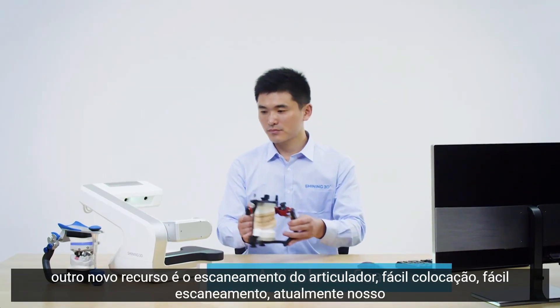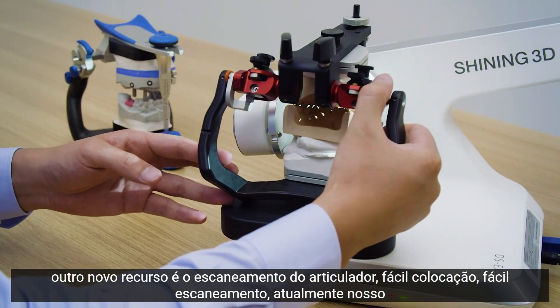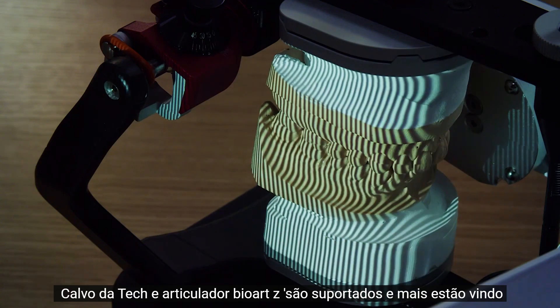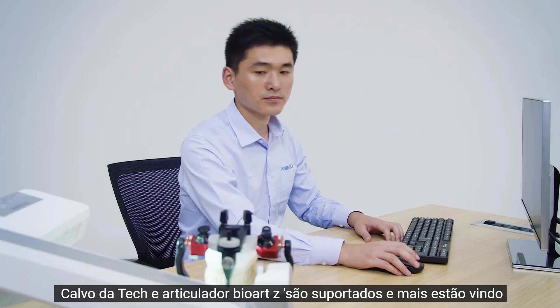Another new feature is articulator scan — easy placement, easy scan. Currently, Artex, CAVO, and BioArt articulators are supported, and more are coming.